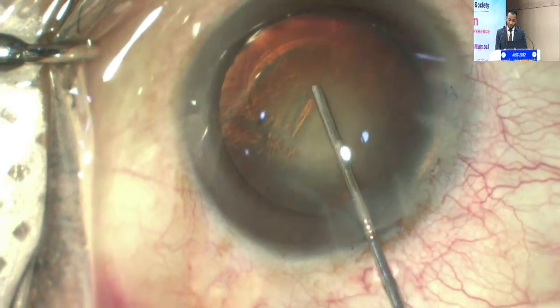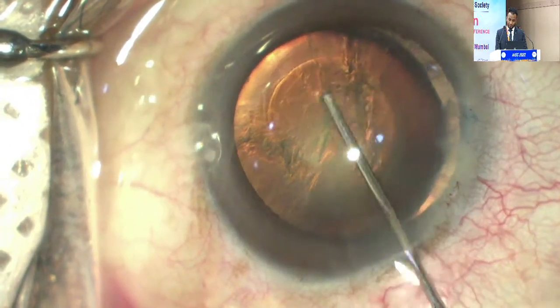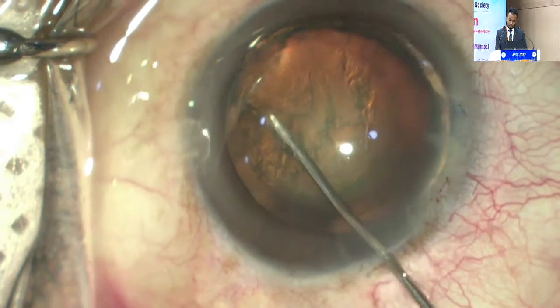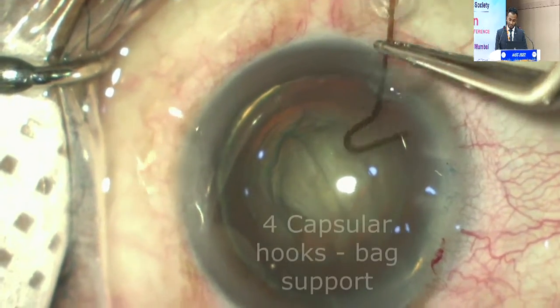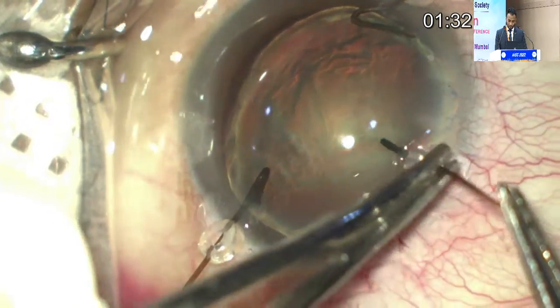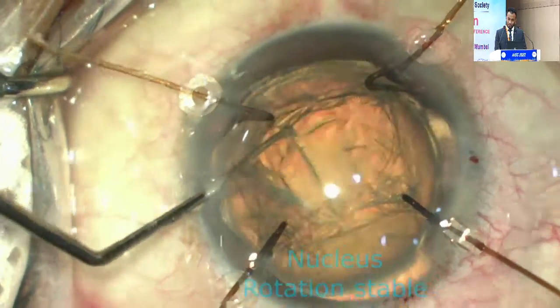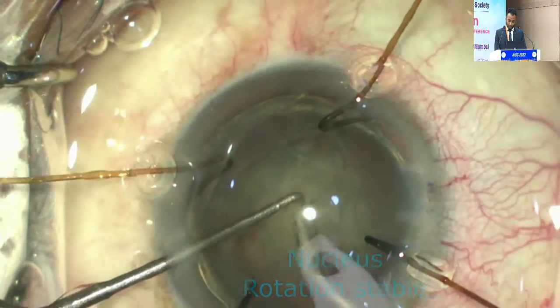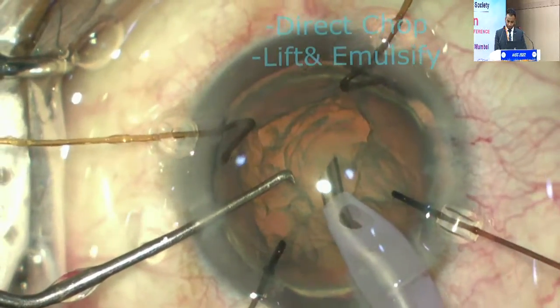Since this was a large 4 to 5 clock hours zonular dialysis, so after this, just a small bolus of injection. I've decided to fix the bag first with 4 capsular hooks. And then I've decided to rotate it because it has distributed the forces well. The anterior zonules were pretty fine. Going ahead with the phaco surgery, low parameters, a direct chop technique.